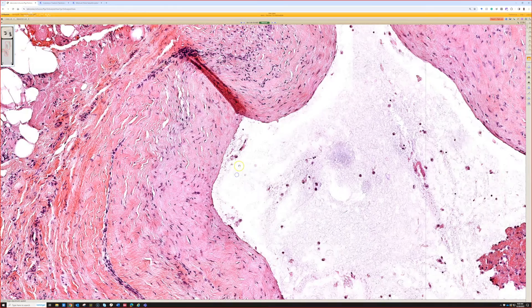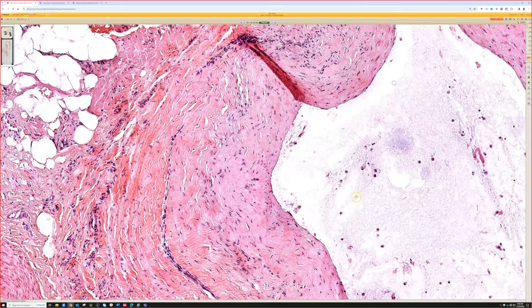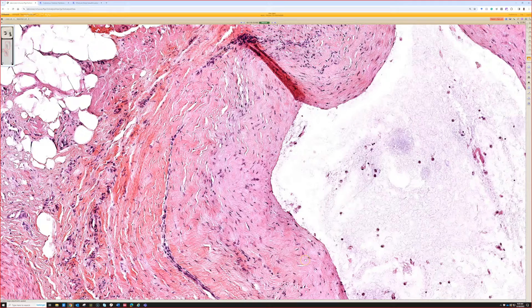Even though there's no lining, you can tell this is the edge of a pseudocyst. Even if we took the mucin away and just had this piece of tissue, I would argue this is the edge of a pseudocyst. I can't fully explain it, but it looks too perfectly flattened along the edge to have just been torn away during surgery or to be an artifactual space - something in the patient's body compressed this collagen and made this pseudocystic fibrotic lining.